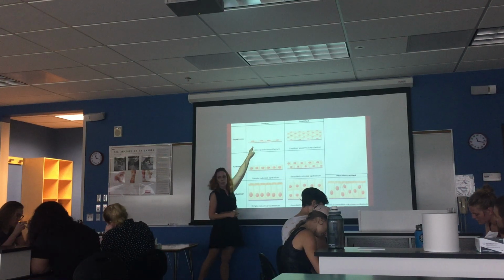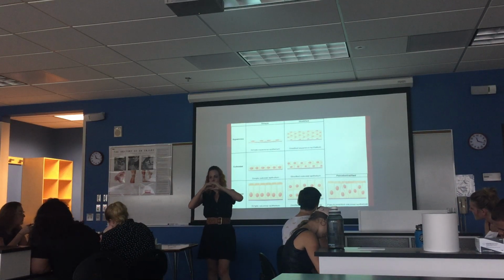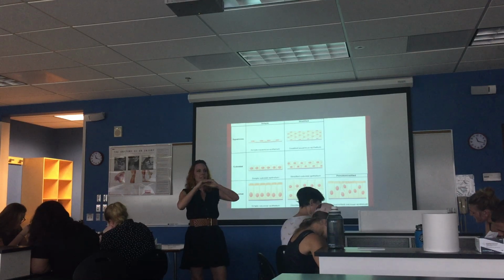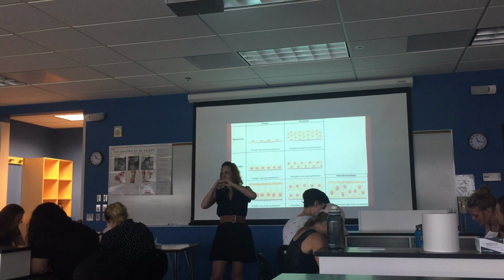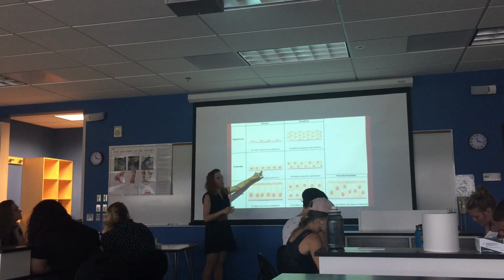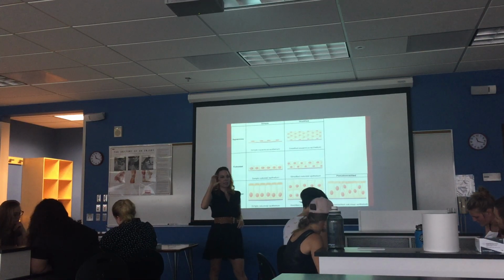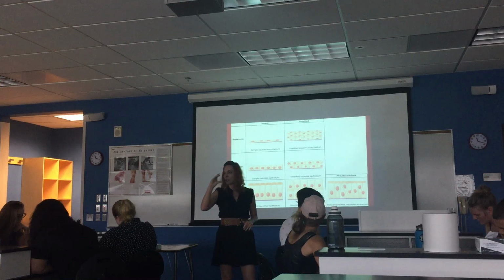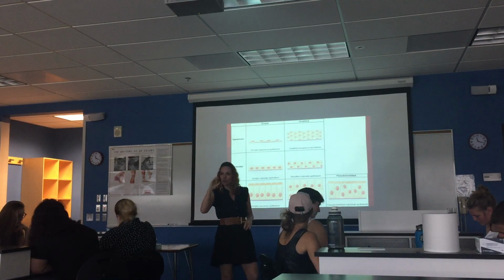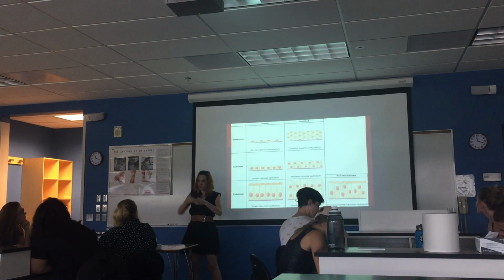They are going to be squamous shaped. Those are kind of like fried egg or football, flattened football shaped cells, squamous cells. They're very thin, which makes them sometimes hard to see. Okay? There's cuboidal cells that are equally tall as they are wide. They're very symmetrical, roundish, cubish. Okay? And then columnar cells are taller than they are wide.